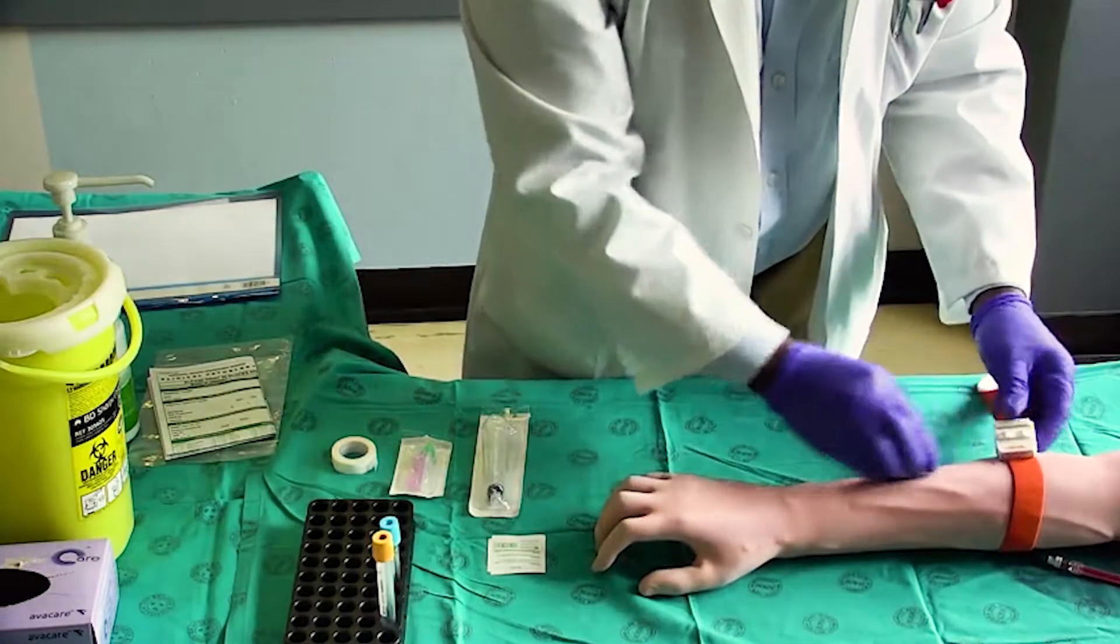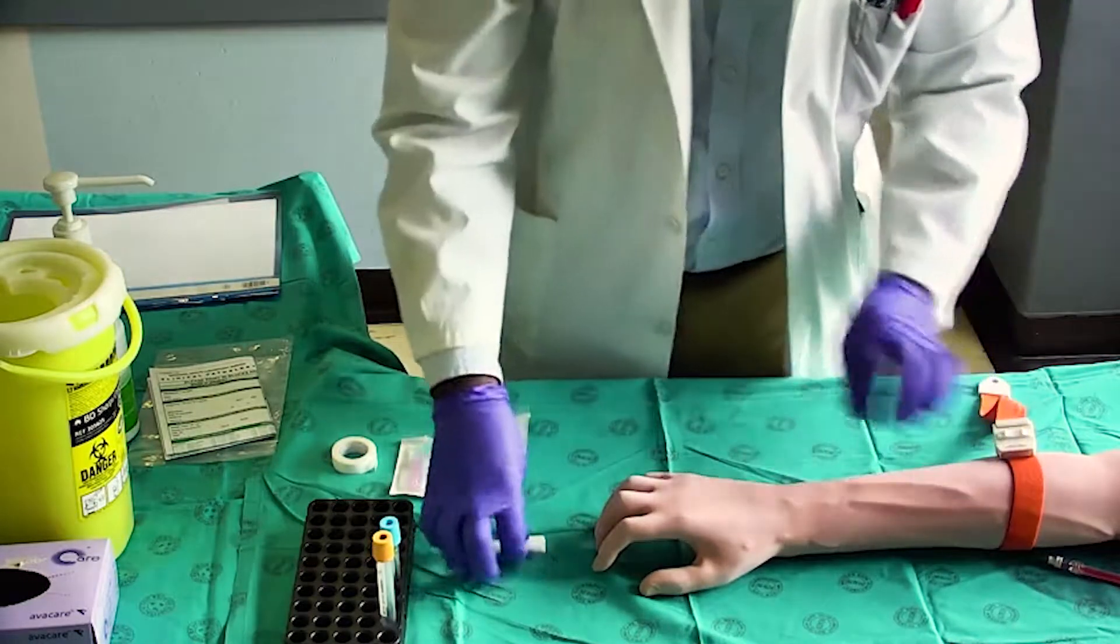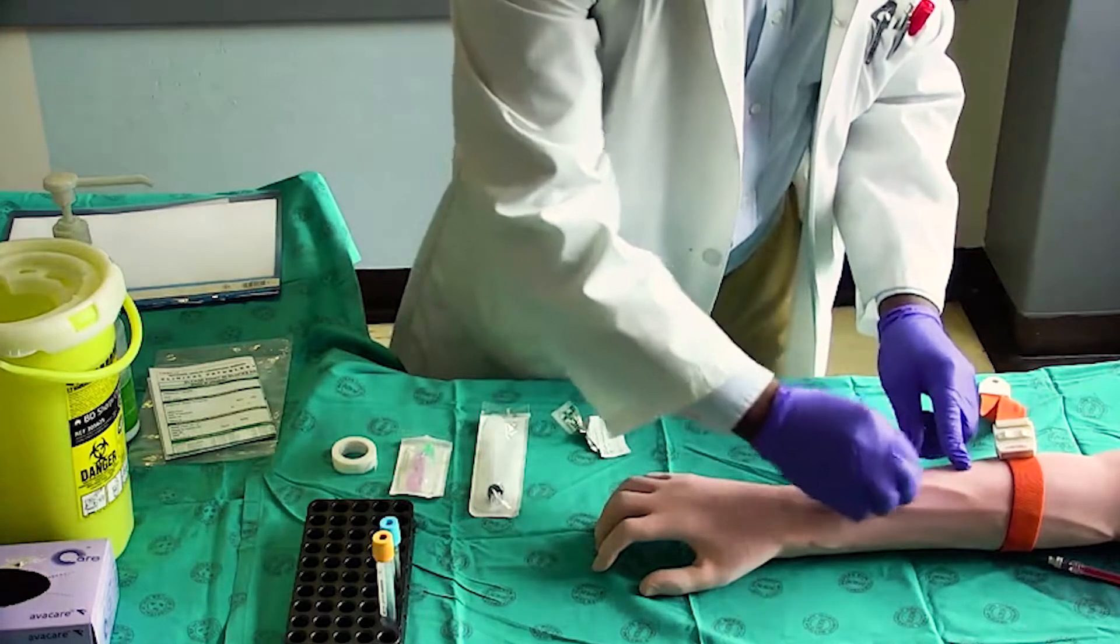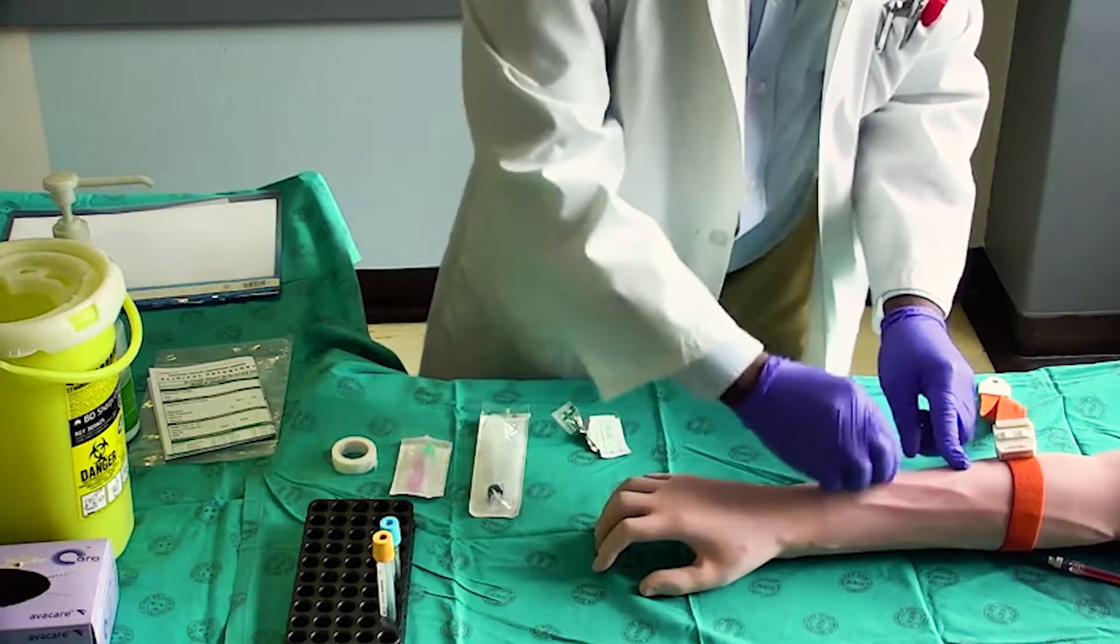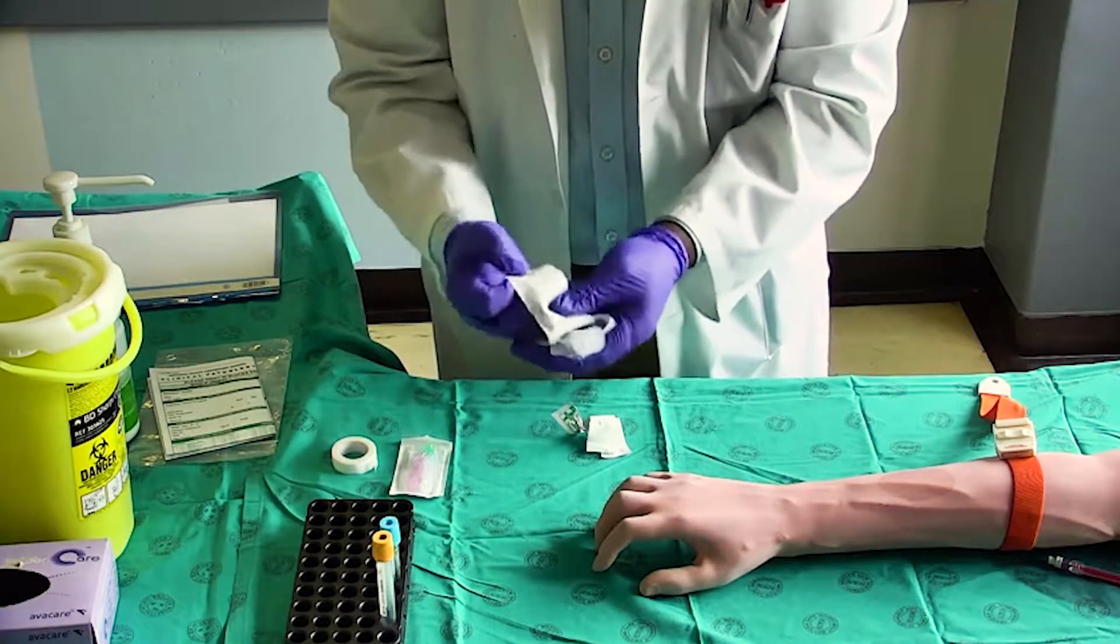Apply the tourniquet four to five finger widths above the antecubital fossa. Locate and palpate an appropriate vein. Clean the area of skin with an alcohol swab for 30 seconds in a circular motion from the center outwards. Allow the skin to air dry for 30 to 60 seconds.